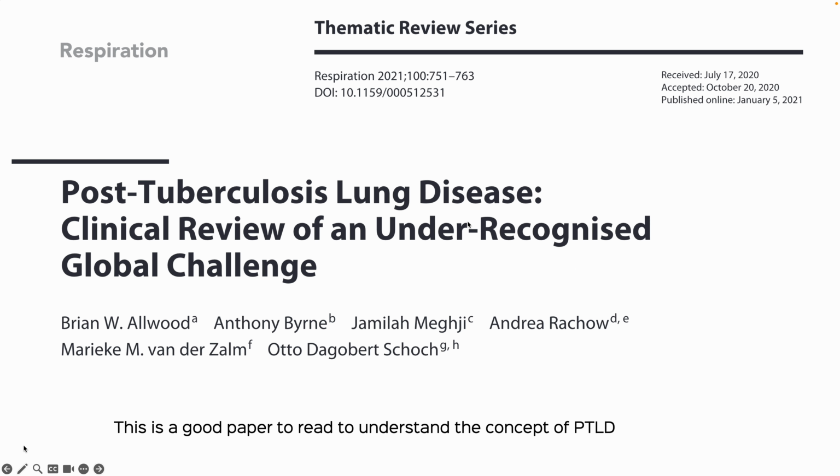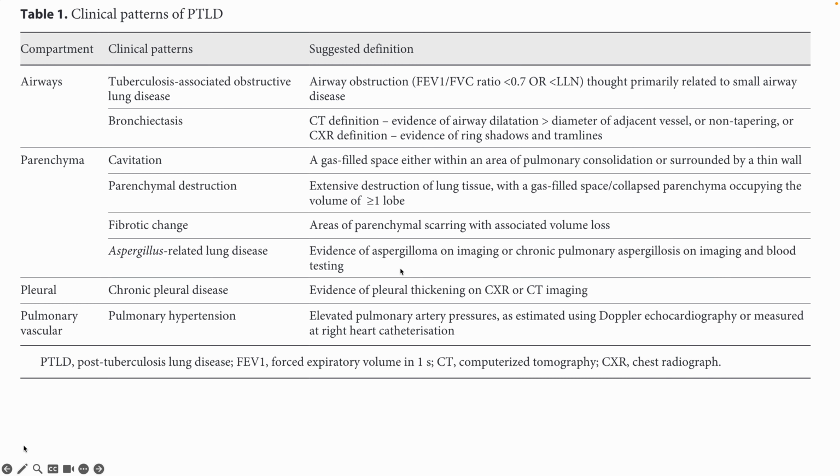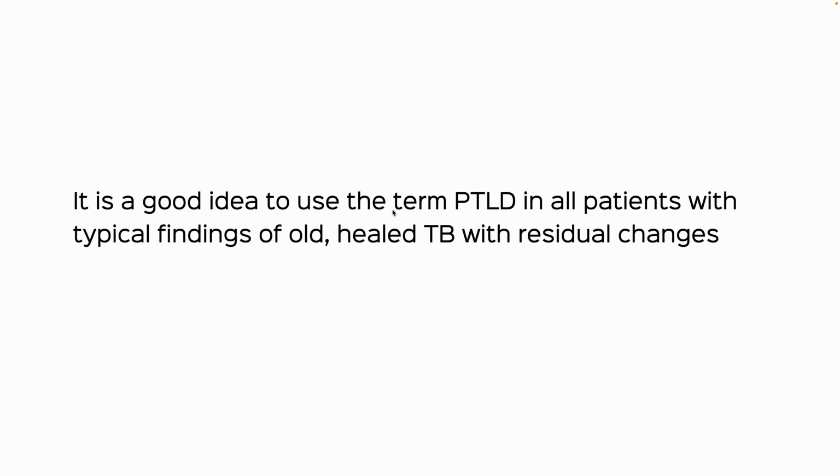And I think everyone who reads TB scans should read this article from 2021. It's free to download, and it has this table that describes all the different changes that can occur with past tuberculosis or a part of PTLD. So it's just a good idea to use this term.